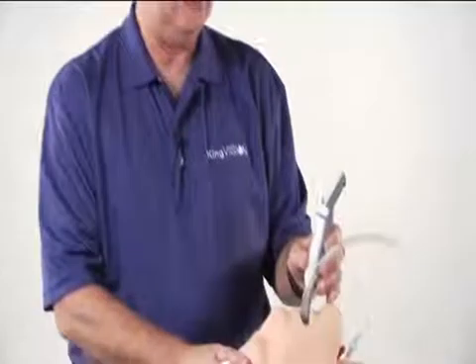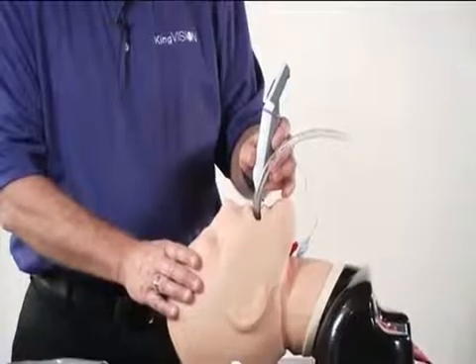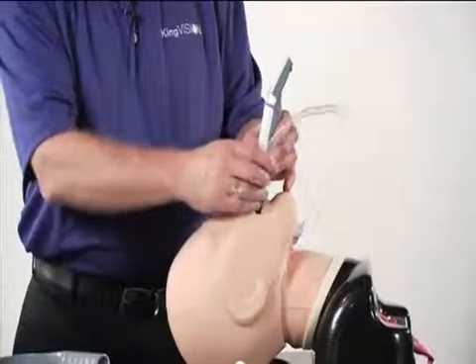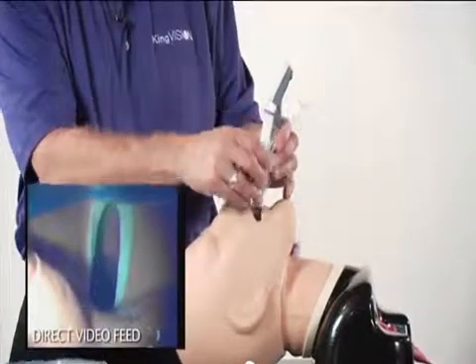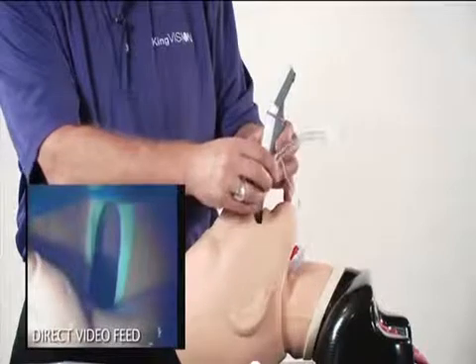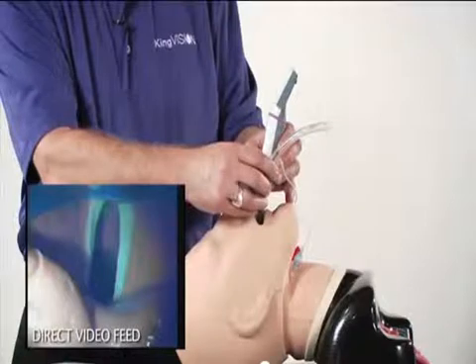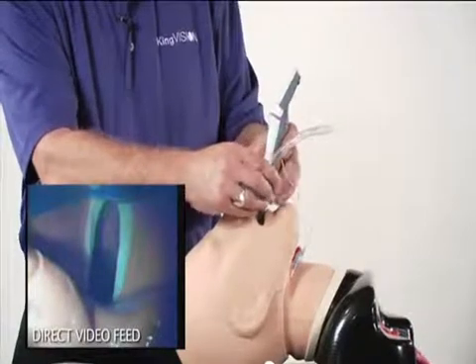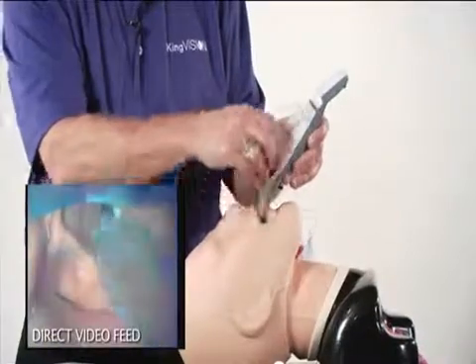It's very important with the King Vision video laryngoscope, like other video laryngoscopes, to not attempt to get a view that's too deep. In other words, the view of the vocal cords is up close and personal. What this accomplishes is you have a great view of the vocal cords, but the imaging sensor is in the way of the advancing tube. And so it's very difficult to advance the tube, and you're typically going to run into the right border of the laryngeal inlet or the right arytenoid. If this occurs, be sure you back out, lift up a little bit before advancing the tube into position.